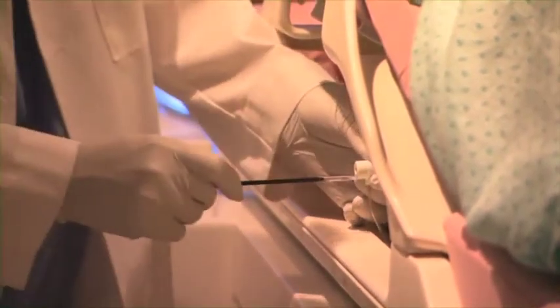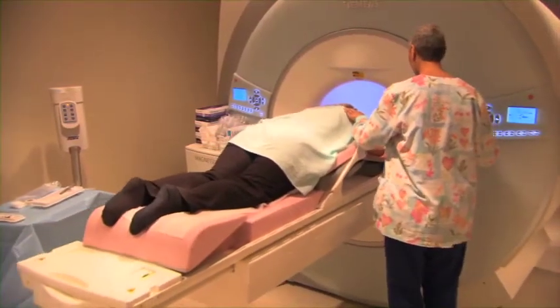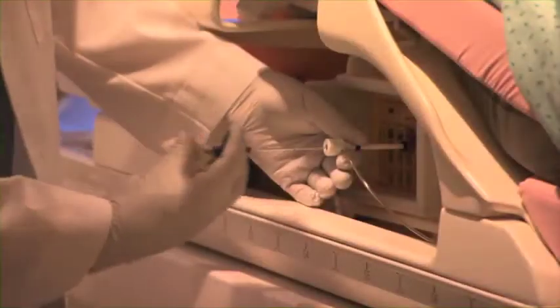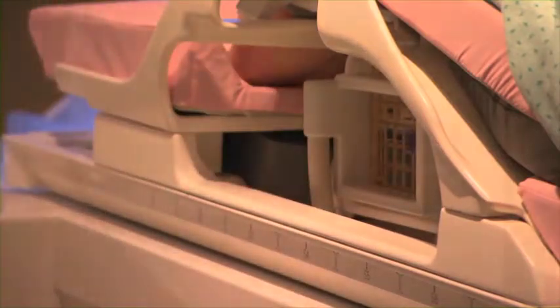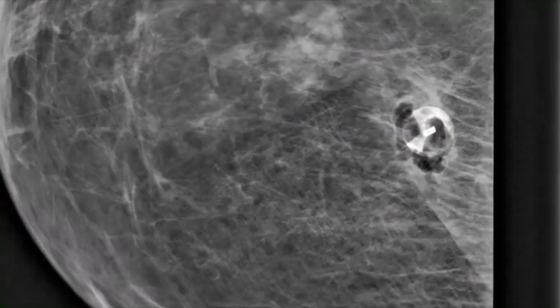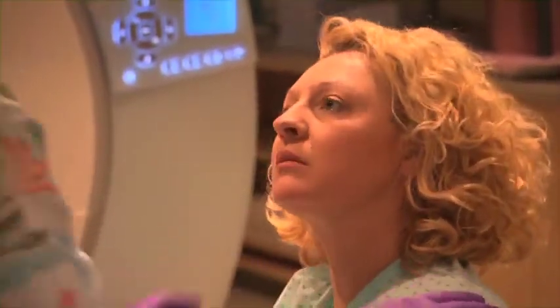After they've taken the sample, they will reinsert the obturator and move you back into the magnet for a final set of images, just to confirm that everything worked as it should. Finally, a tiny marker is placed at the spot where they took the sample. This can be seen in future mammograms to show the location of this biopsy and to minimize the chance that this location would be biopsied again. Some physicians may take an additional scan to confirm the marker's placement. Then your procedure is finished.